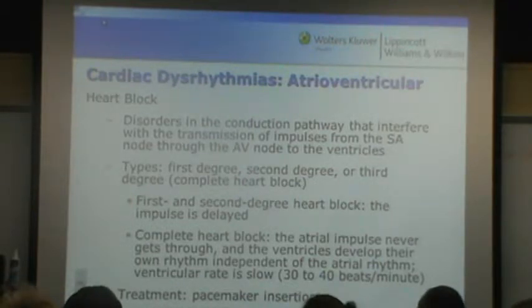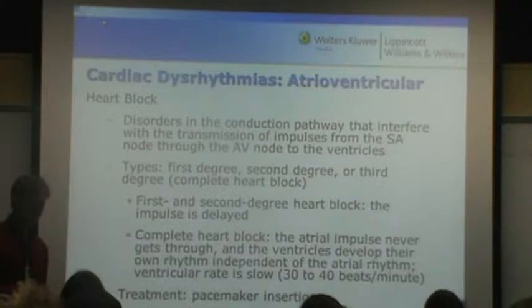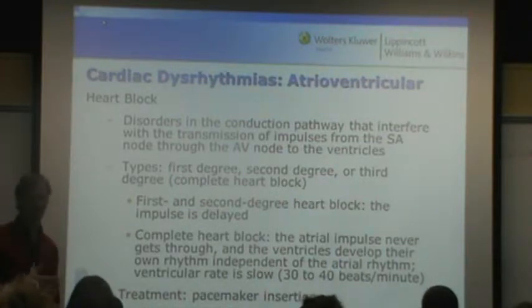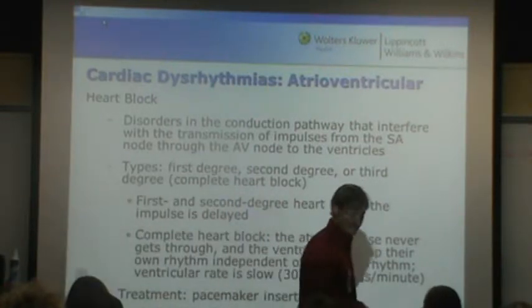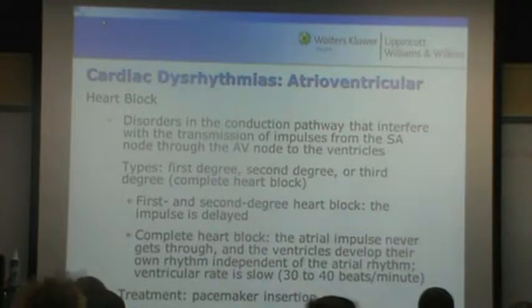That one just happens to be one of the fast AFibs. Because remember, it can be a normal rate. It can even be a slow rate. But oftentimes, when patients present with it, it's because they're having a problem because of the fact that it's fast. Yep, absolutely. Yeah, that one is sinus tach. Everything's normal, it's just fast.